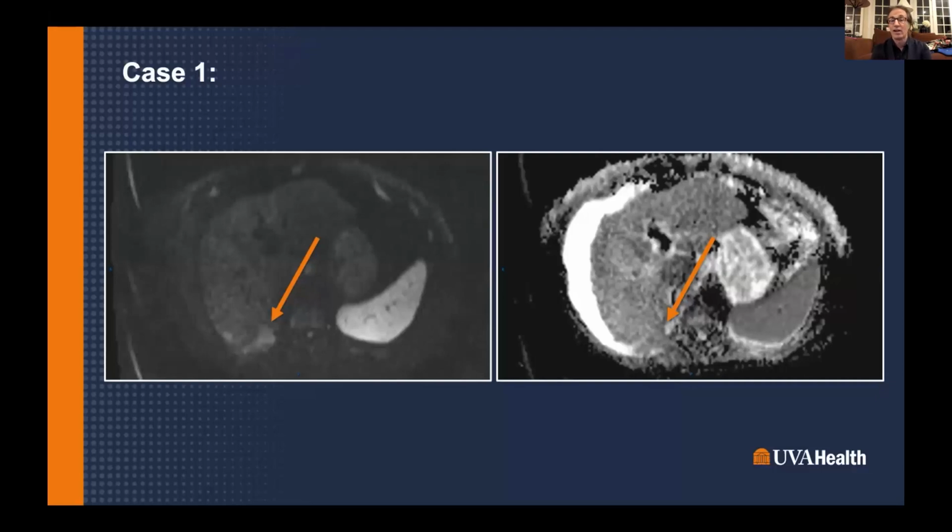And I think it looks like our last question will be to Professor Khot, which is, are you aware of any comparative study for the use of contrast-enhanced ultrasound that looked at post-TACE and histology as the gold standard for accuracy?